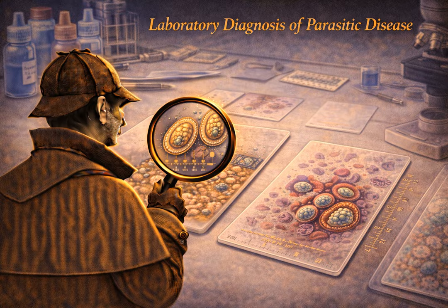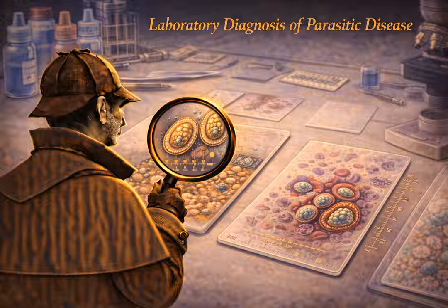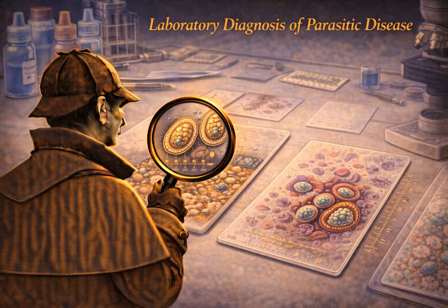Now, beyond compliance, there are also what we call deal breakers, things that absolutely ruin the sample completely. The do not collect list. What's on it? Top of the list by far, barium. If a patient has recently had a barium swallow or a barium enema for a radiology scan, you are completely out of luck. Barium is chalky, it's bright white, and it is incredibly dense. It physically, optically obscures the microscopy. You just can't see through it. You can't see a semi-transparent amoeba cyst through a solid wall of white chalk.